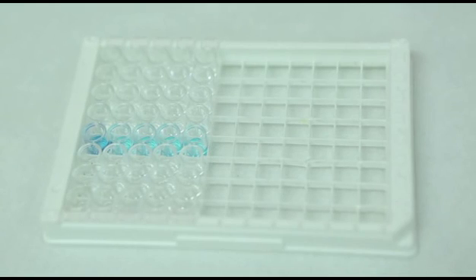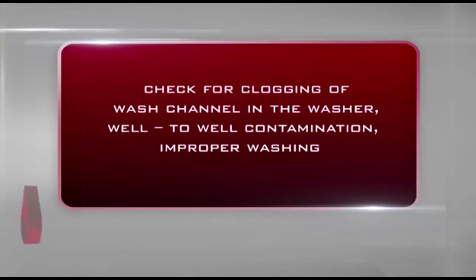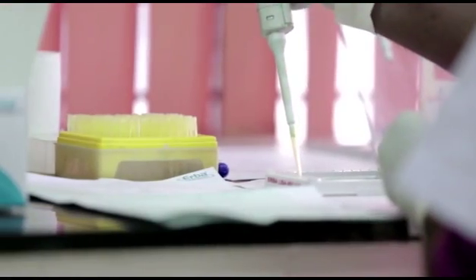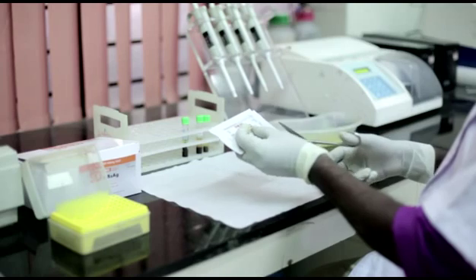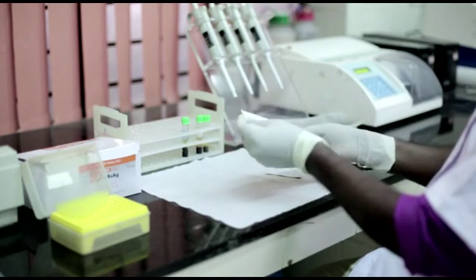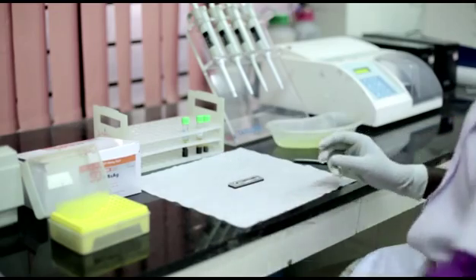Likewise, if there are bad results in one column or row, check for clogging of wash channel in the washer, well-to-well contamination, improper washing. Always remember, even third generation ELISA testing cannot detect the antibodies during the window period. Rapid diagnostic tests. When ELISA testing is not feasible during emergency situations, rapid diagnostic tests based on immunochromatography are done.